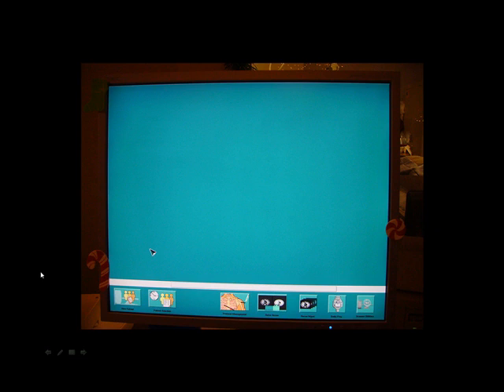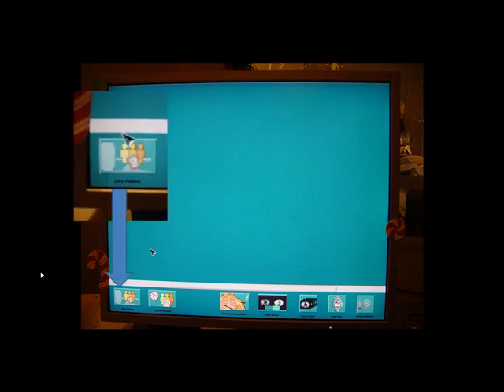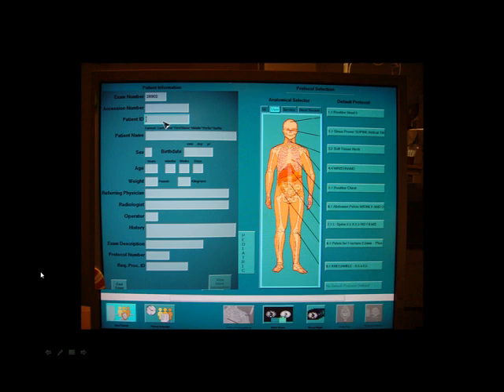Now you know how to position the patient inside the room using the gantry. Now let's go to what it looks like when you're sitting down at the control panel. This is the screen that you will see to your left, the left monitor. You're going to click on this button to bring up the new patient. And this is the screen that you will see.